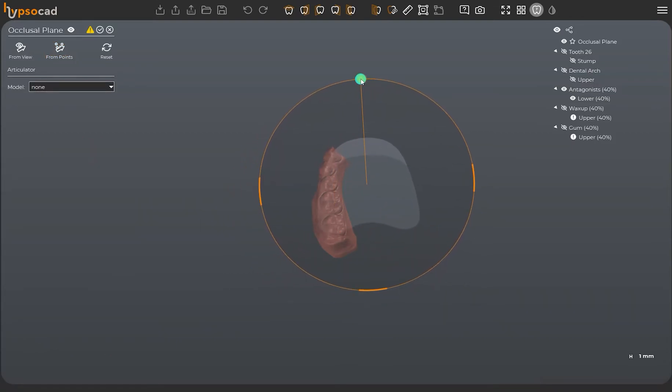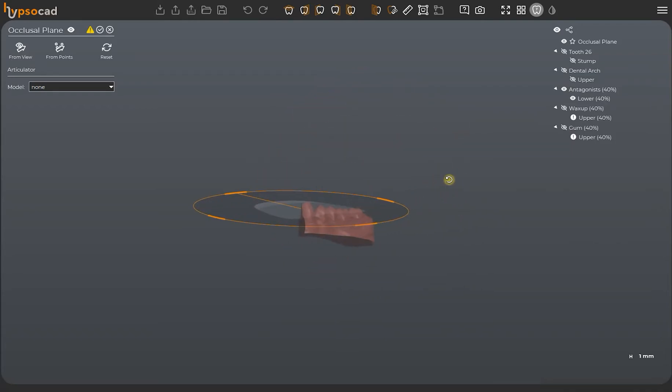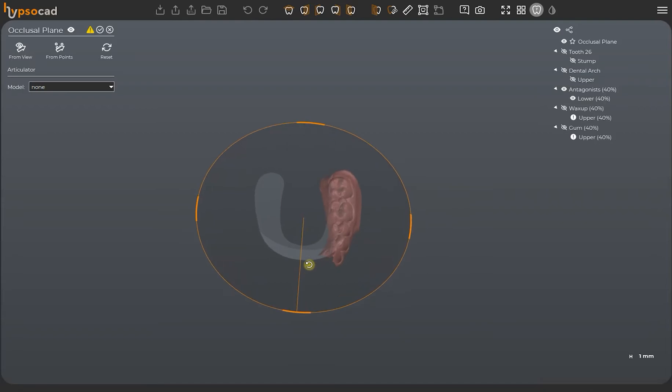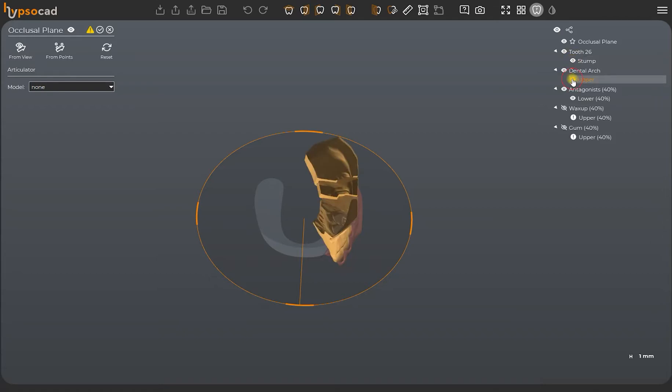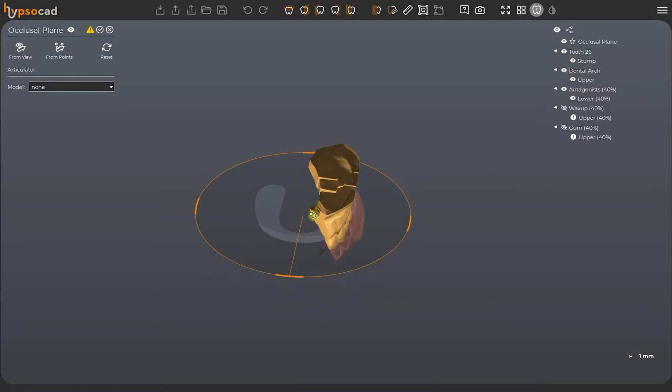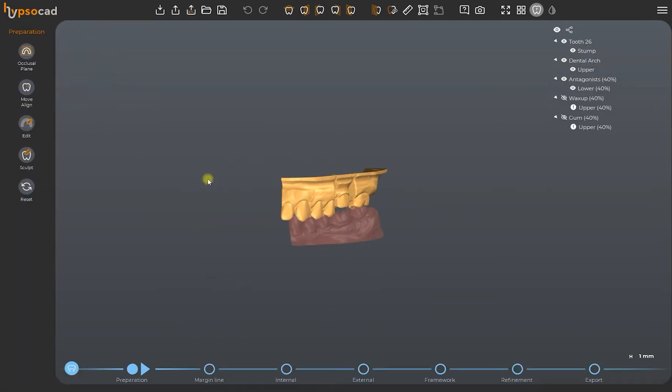We will check again the correct inclination of the plane. And if necessary, we may modify the occlusal plane by using the methods described above. Once we are satisfied with our occlusal plane, we can click on OK and proceed to other changes.